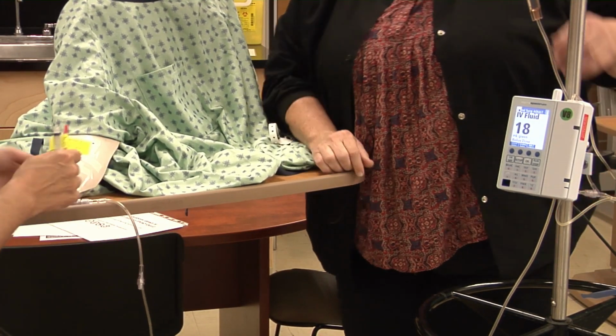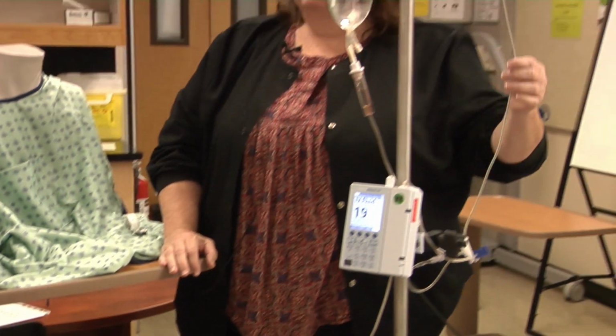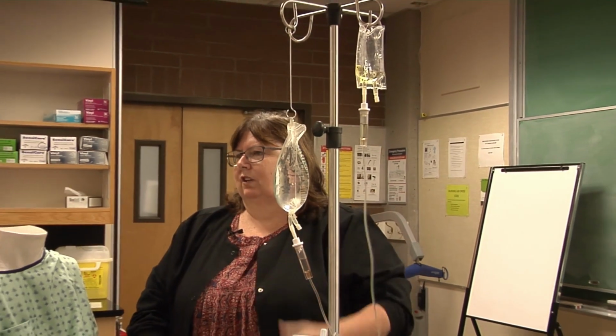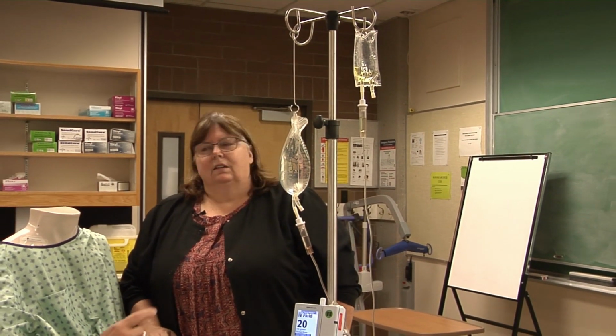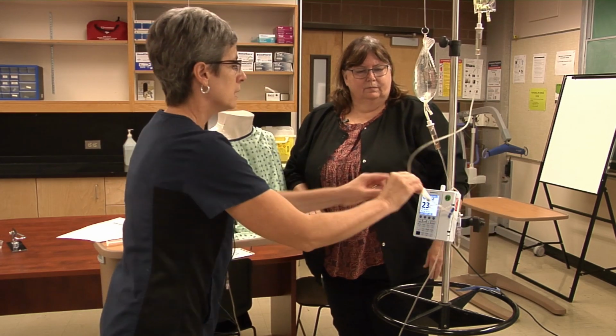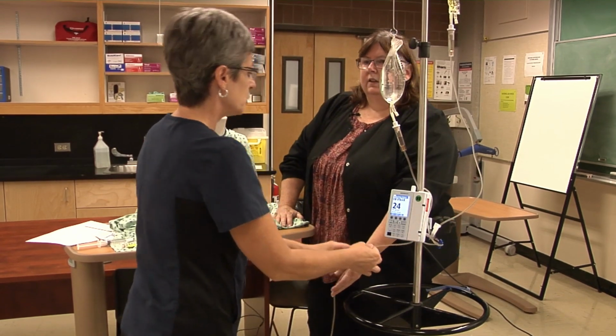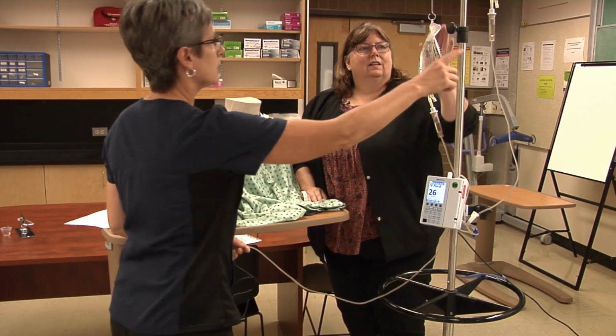So what would we do if, say, the secondary medication was not compatible? How would that change what you did? Okay, so then I would have to think about what this medication is. Can I temporarily stop it while I push my med and then restart it or not? So let's say you could temporarily stop it. You can simply clamp your secondary line. Okay. And then do we worry about what's in here? Yes, you do. So then you're going to run a bolus to flush this out. Then you're going to give your drug, and then bolus it again, and then restart that medication that's incompatible.